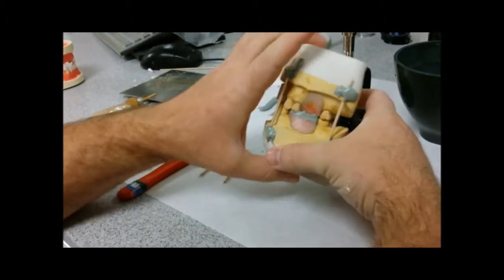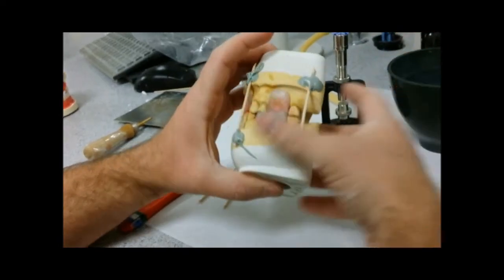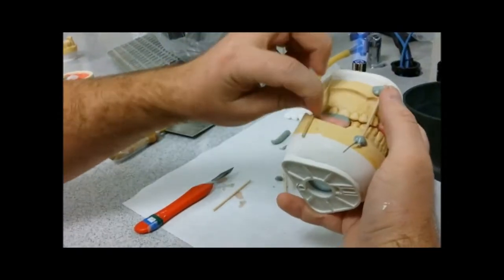And then you're ready to use these to place them on. Or what you can do is get you some metal coat hangers and cut them to that distance and you'll have them always, you'll just keep reusing them. And I'm going to show you how to do that, the gray stick compound.